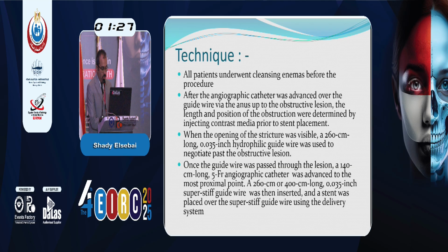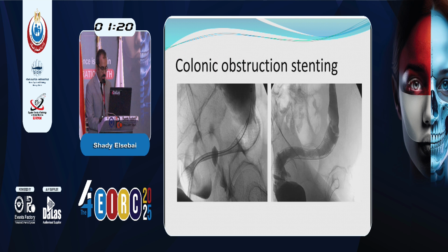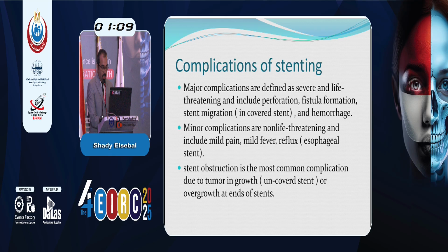Then a super stiff guide wire was inserted and the stent was placed over the super stiff guide wire using the delivery system. This is a case of colonic obstruction stenting. Here is the stent through the obstruction, and after deflation, the contrast passes through it normally.